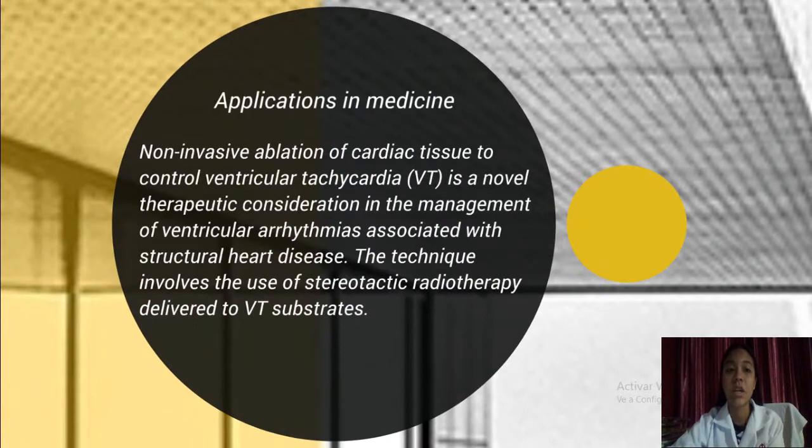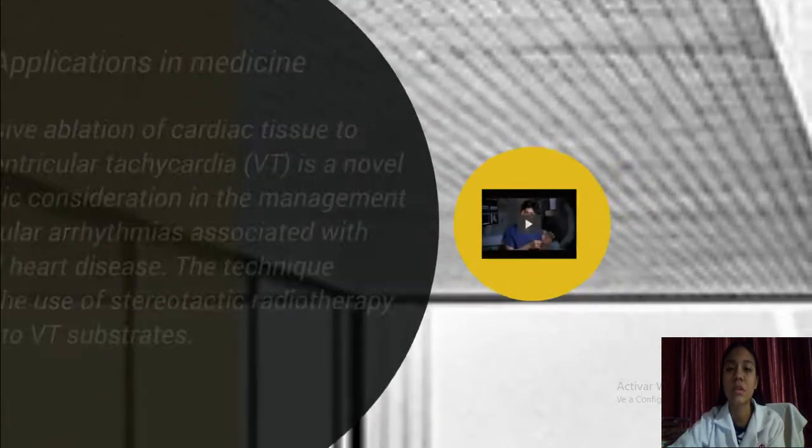Applications in medicine. Non-invasive ablation of cardiac tissue to control ventricular tachycardia, or VT, is a novel therapeutic consideration in the management of ventricular arrhythmias associated with structural heart disease. The technique involves the use of stereotactic radiotherapy delivered to VT structures or substrates.